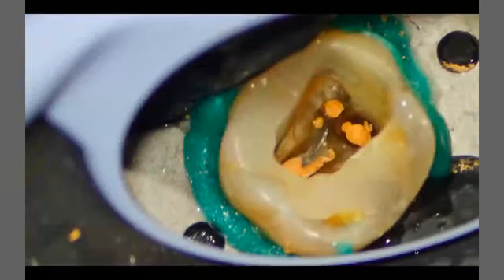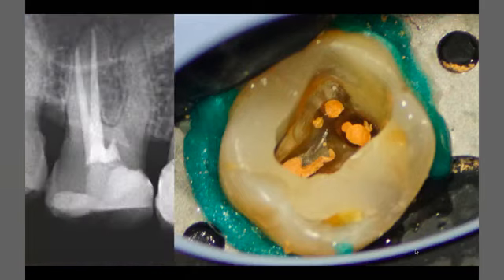Yes, this one. If you see this axis and you can see clearly the data for MB1, MB2, buccal and palatal, you will see that everything looks great. But according to the X-ray, you can see that we have a missed mesial root because of calcification. Because of the calcified mesial root, the previous dentist couldn't negotiate the root canal.